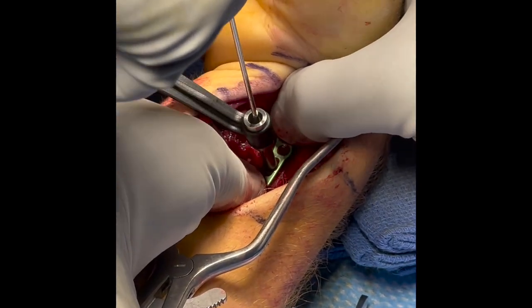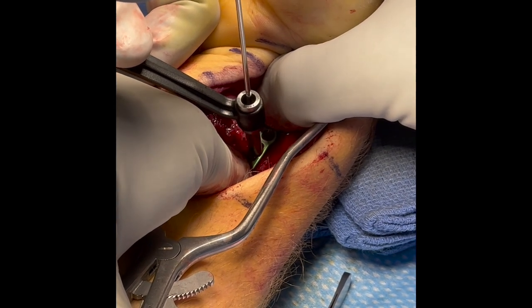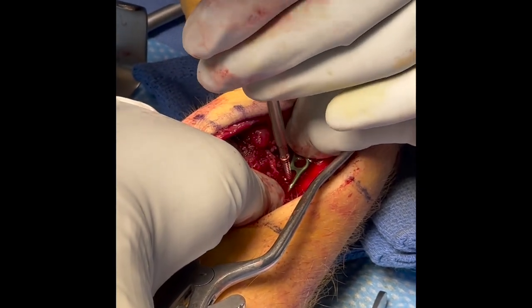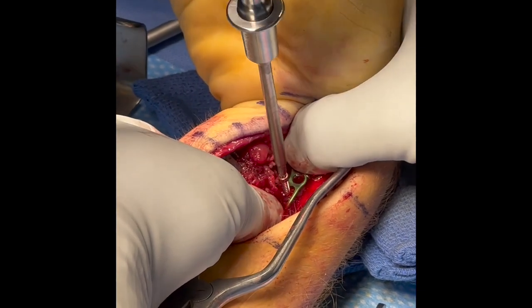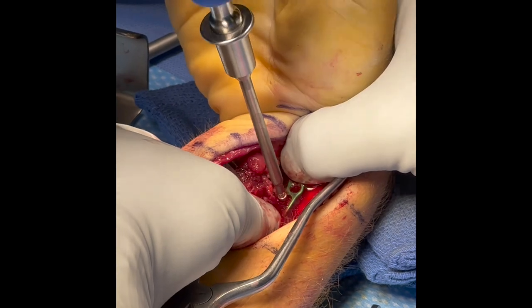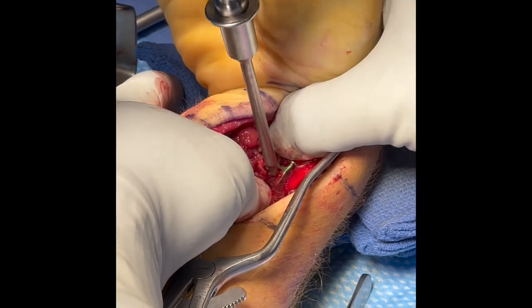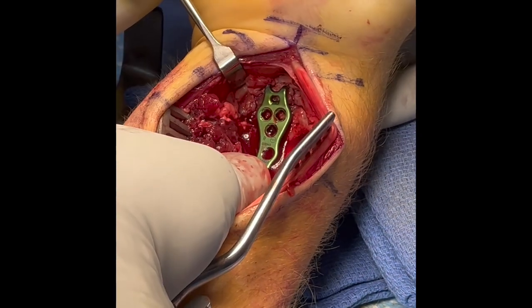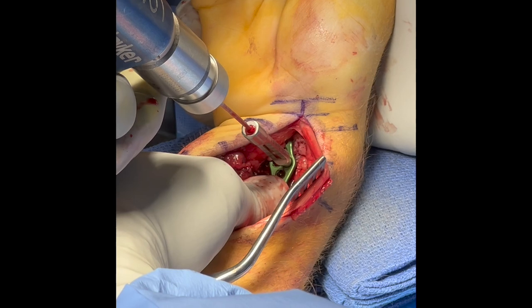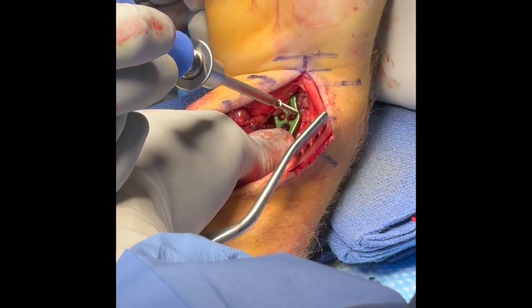The first screw is placed in the oblong slot. This can be a locking or non-locking screw with the NuClip system; in this case, a non-locking screw is placed. Next, the distal screws are placed. It is more advantageous to place the distal screws first, as it allows the hook of the plate to better stabilize and engage the distal fragments.